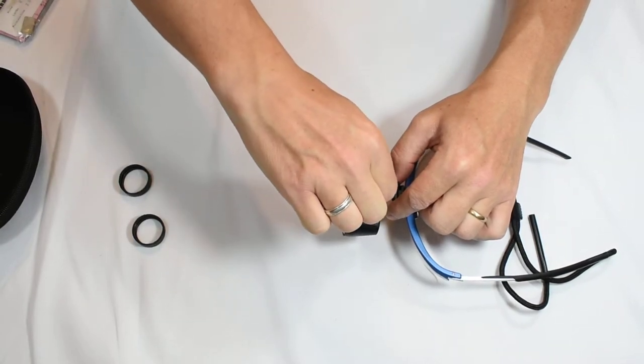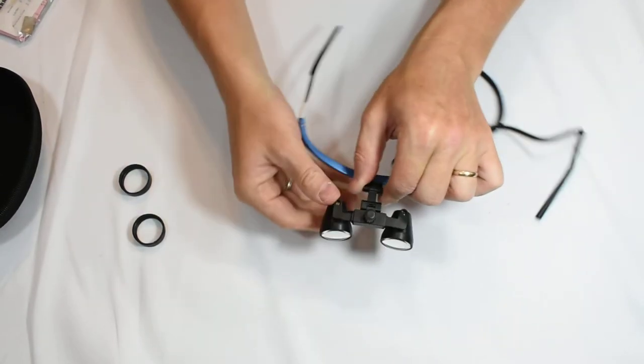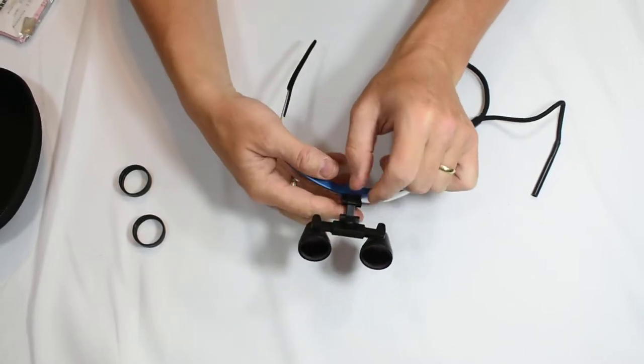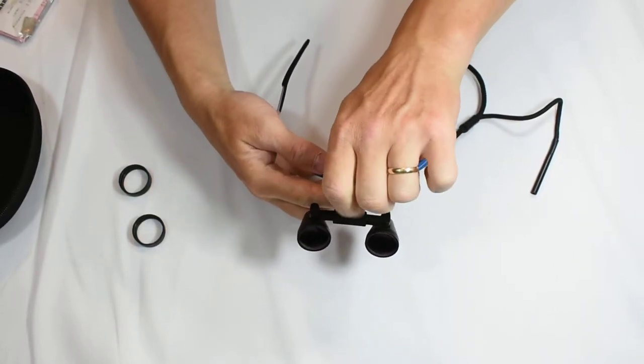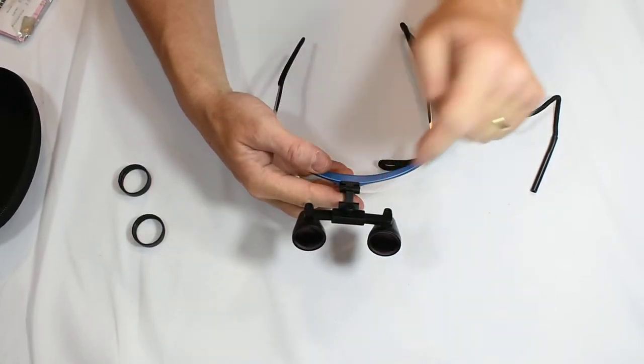And here on top we have the PD adjustment knob. You can see as I turn that knob that the telescopes themselves will move in and out.